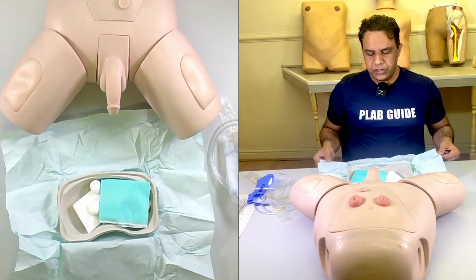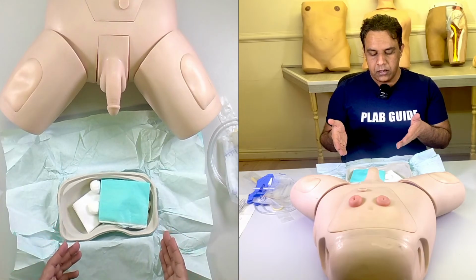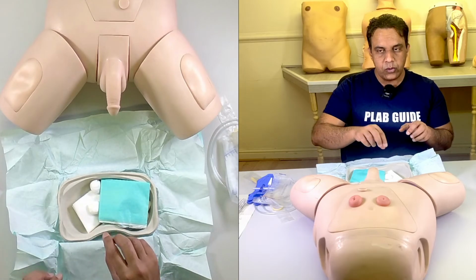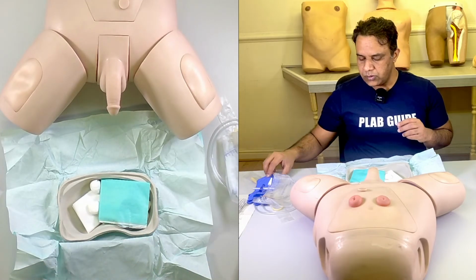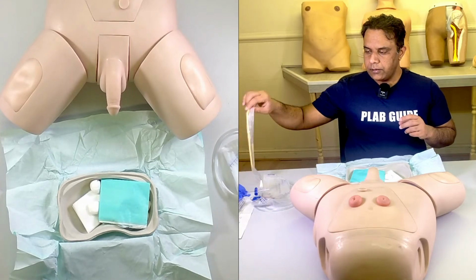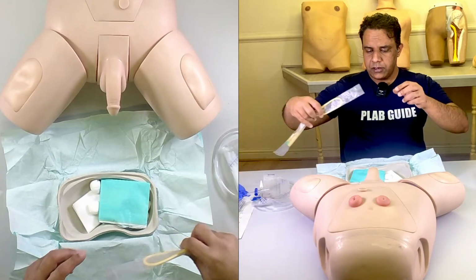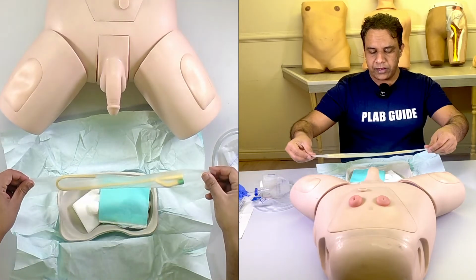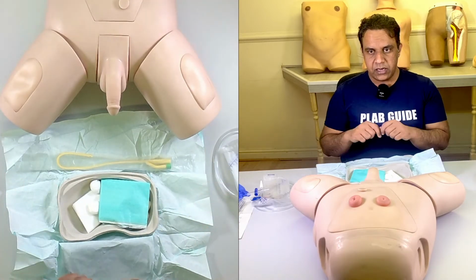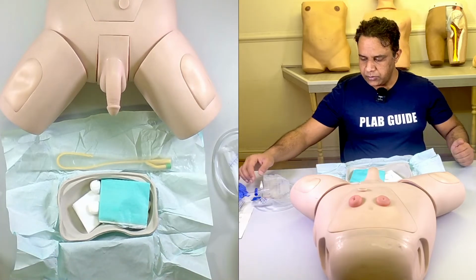Now when you open this, you will see a kidney tray and a sheet to drape the patient, and a few gauzes and a few balls of gauze. These are to clean. Then you open the catheter, the outer packet here. It is normally covered with an outer packet as well. I have taken that out just for the sake of this video.